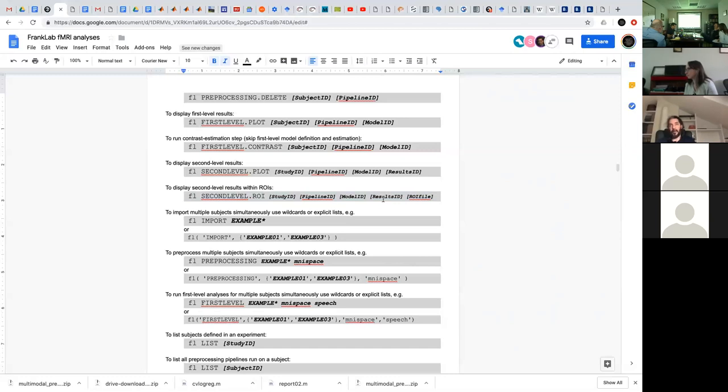Basically, the estimation of the residual maximum likelihood model, which tries to approximate the scan-to-scan temporal covariance, the amount of cross correlation in the time series, is going to cause these two ways of doing the analysis to be slightly different. But because it's not exactly clear which one is best, I'm not convinced that it's worth having both options, because I don't clearly see that one of those will be better than the other one. But I can be convinced either way.